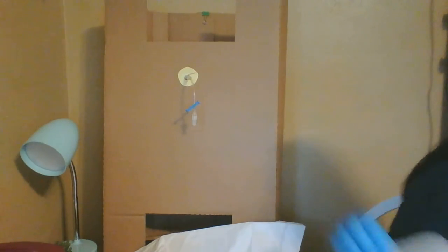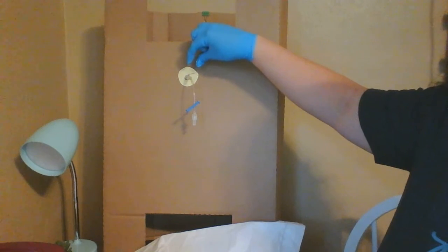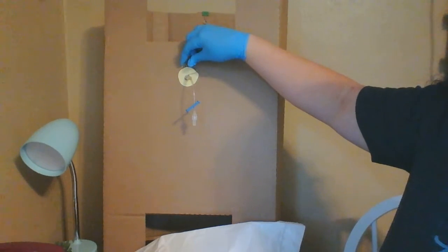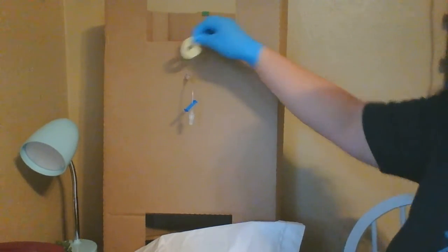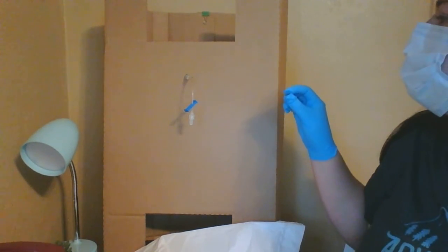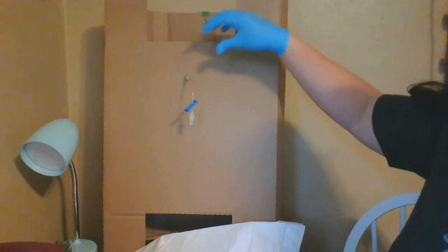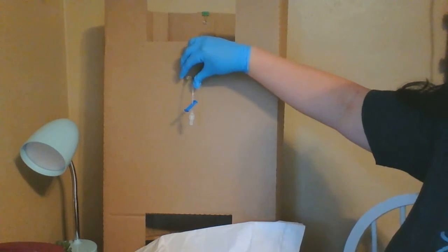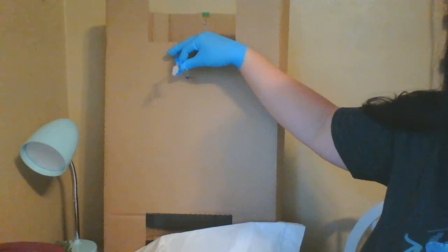So I put this in the vial. And then I will remove my old patch. This is a big patch. And put that in the vial as well. And now I can hold my tubing and start cleaning.